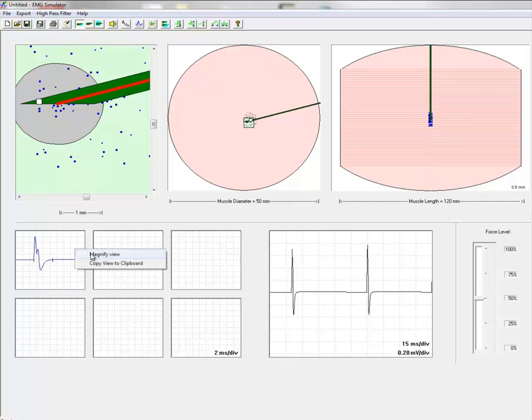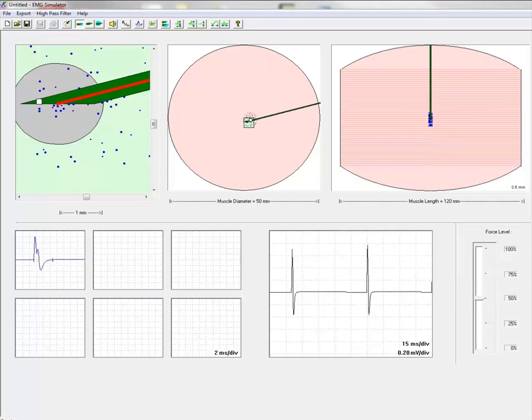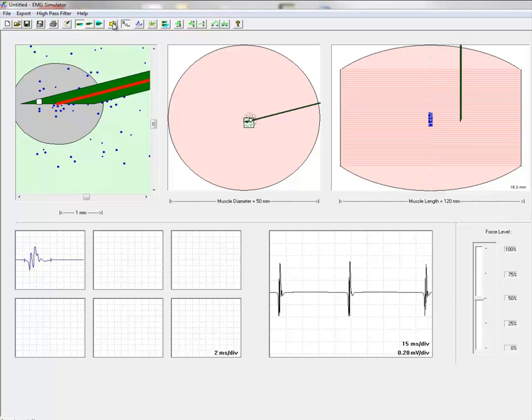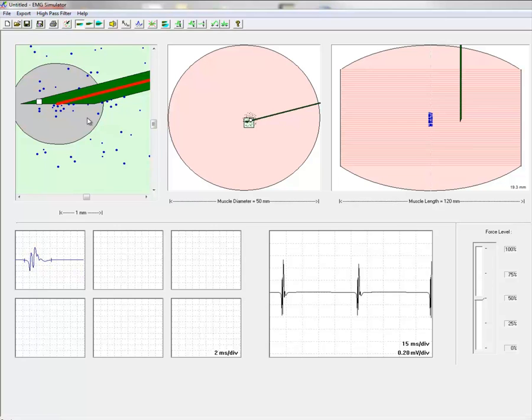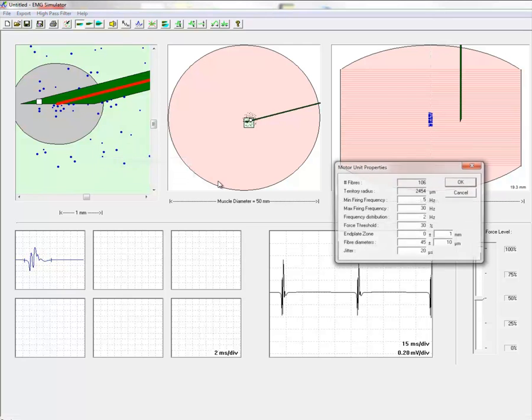Another phenomenon seen in early re-innervation is the uncertain neuromuscular transmission. We can increase the jitter from normal 20 to 80 microseconds and we see the variability in shape on consecutive discharges.